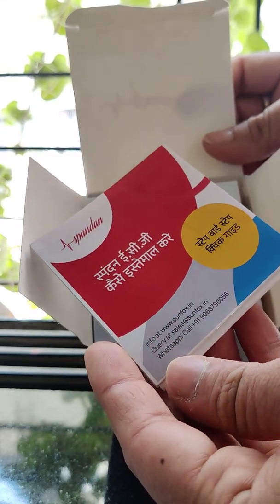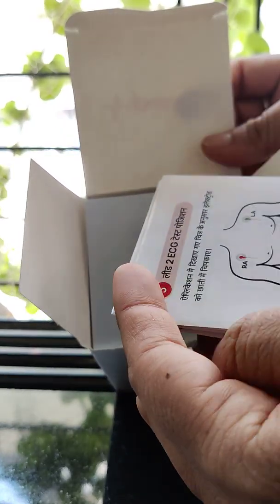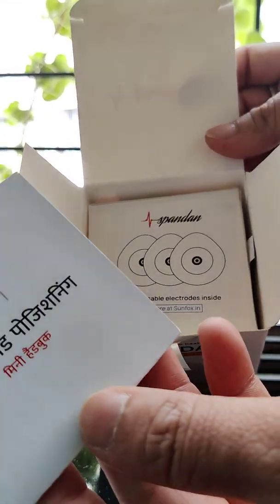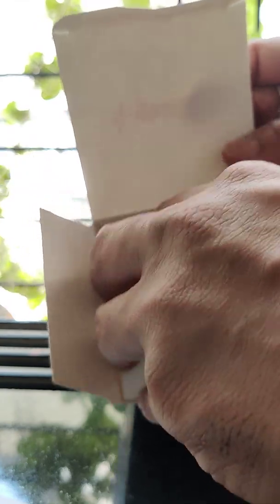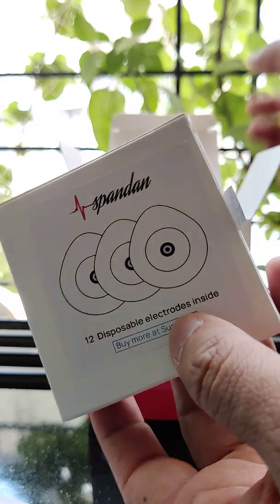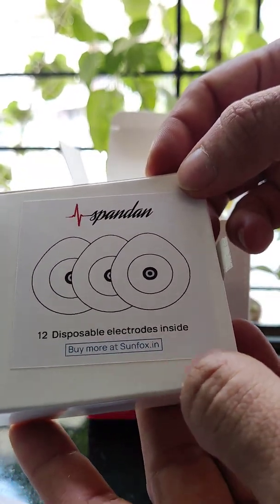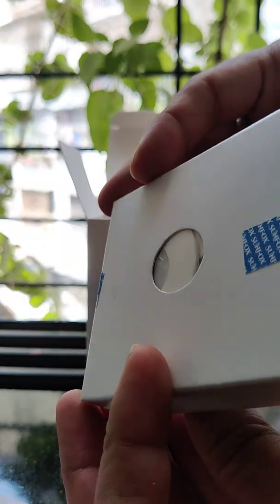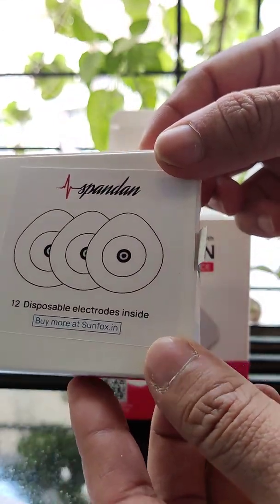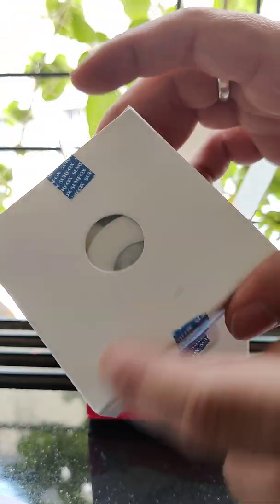You also have this user manual in Hindi, and then another user manual in other languages as well. This is the chest lead. It comes with 12 disposable electrodes, and if you want to buy extra electrodes you can purchase them from the website at sunfox.in.